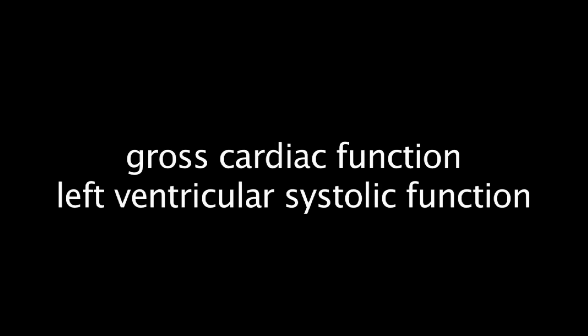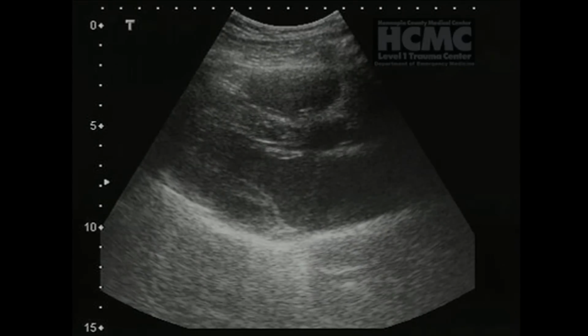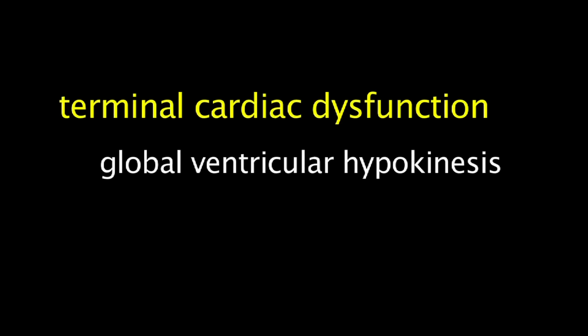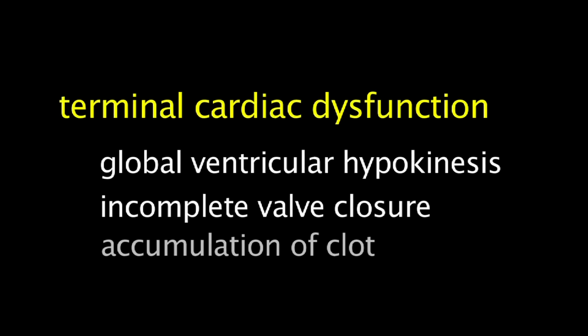Additional primary applications of cardiac ultrasound include evaluation of gross cardiac activity in the setting of cardiopulmonary resuscitation and in the evaluation of global left ventricular systolic function. In the setting of a pulseless patient, the lack of mechanical cardiac activity carries a grave prognosis. Other findings indicative of terminal cardiac dysfunction include global ventricular hypokinesis, absence or incomplete valve closure, and an accumulation of intracardiac hyperechoic clot.